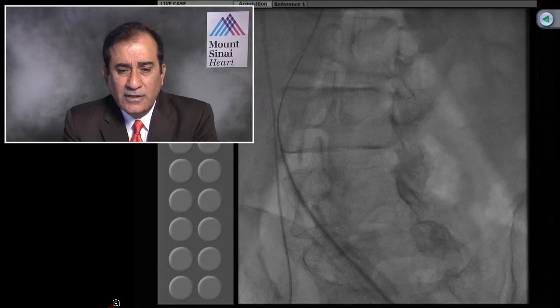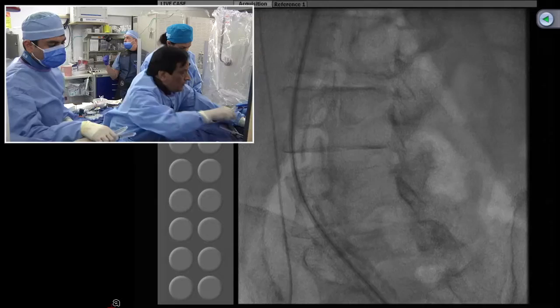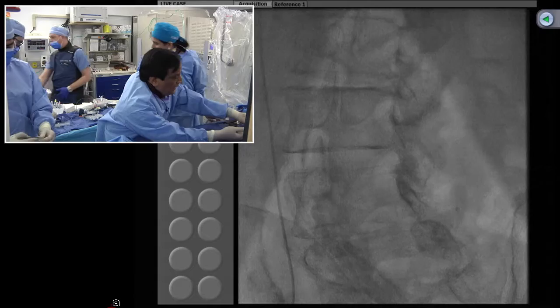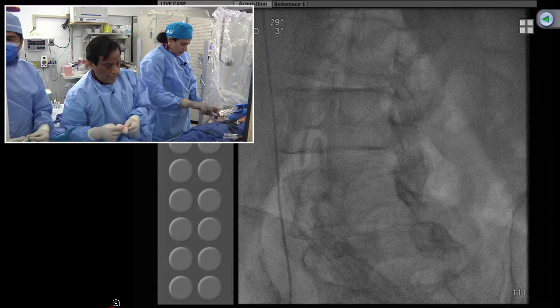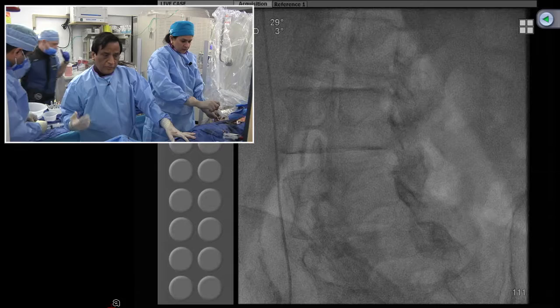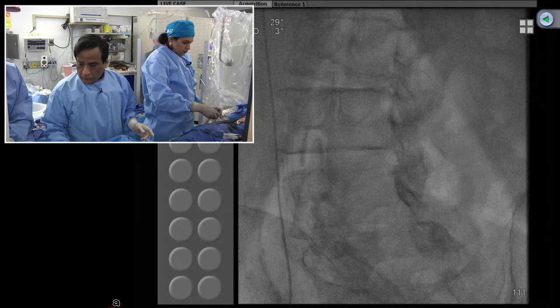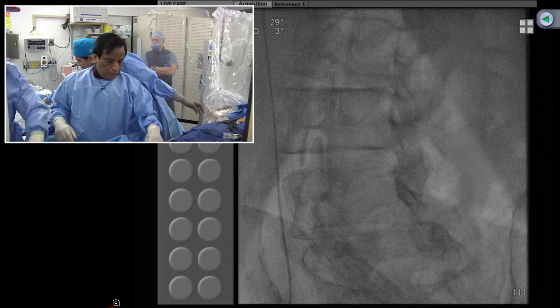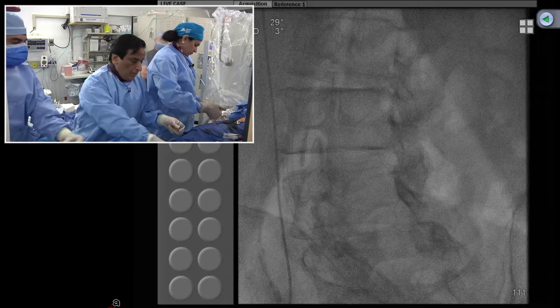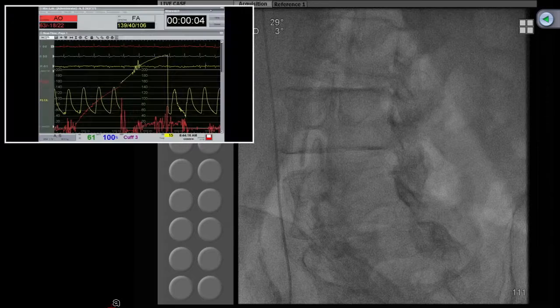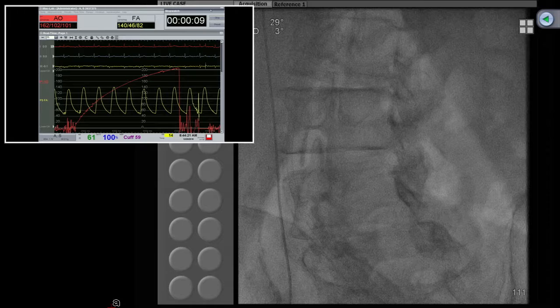Should you be paying attention mainly to the reduced gradient, or are you also monitoring pulmonary arterial pressure? In these cases, we did a right heart cath — essential to calculate the aortic valve area — and right heart pressures were normal. The cardiac output was 3.0, which is decreased but not uncommon. So we took the catheter out and put a pacemaker, which we recommend anyway for complex left main intervention because of chances of developing asystole or bradycardia, particularly in someone with a totally occluded right coronary artery.